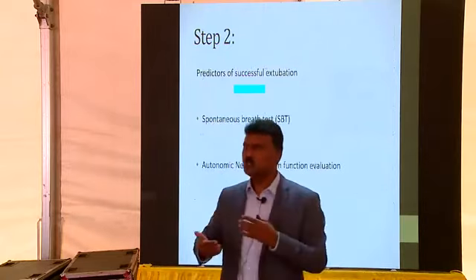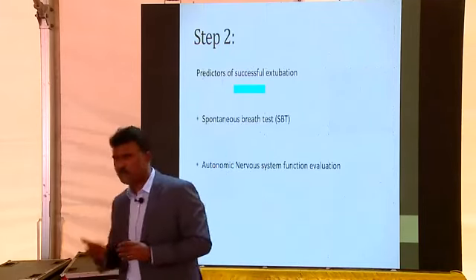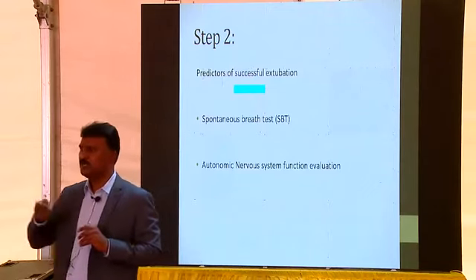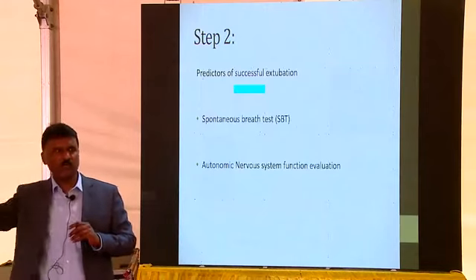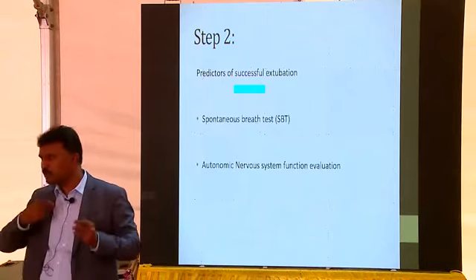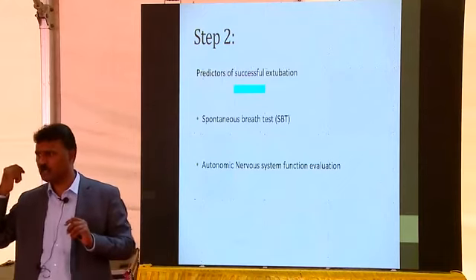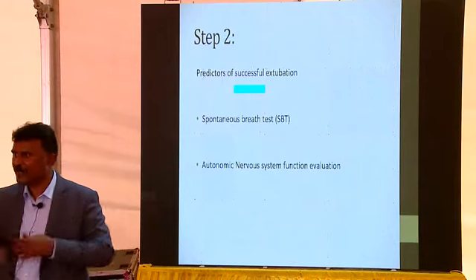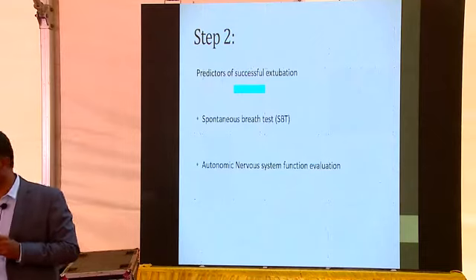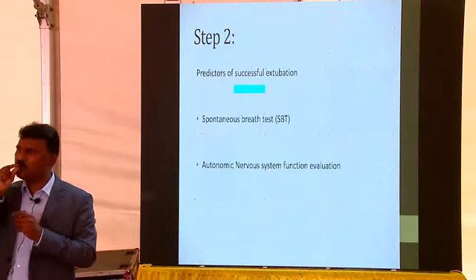What they were doing is, people have tried to put this newborn on CPAP. As a postgraduate, we used to put on CPAP for the next 20 minutes, and then put the baby back on the ventilator. The tube is like breathing through a straw.